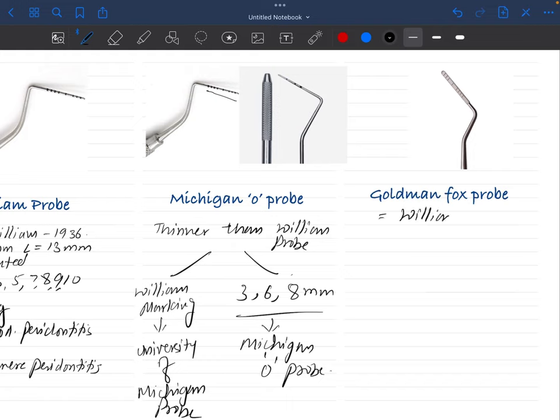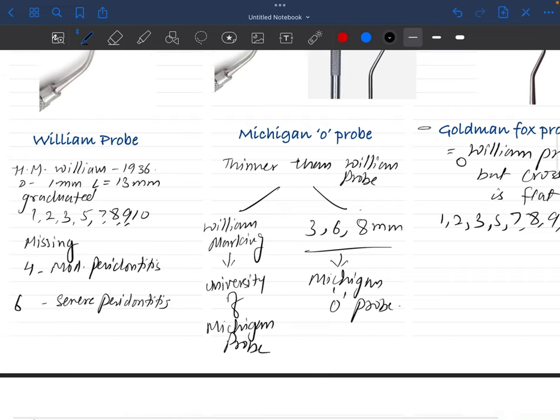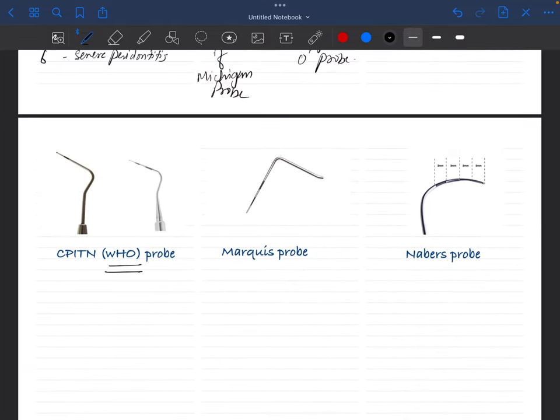The Goldman Fox probe is similar to the Williams probe in terms of markings, but the cross-section is flat — Goldman Fox is flat, Williams is round. The markings are the same: 1, 2, 3 — 4 missing — 5, 6 missing — 7, 8, 9, 10. There is no color coding. It's essentially a flat Williams probe.